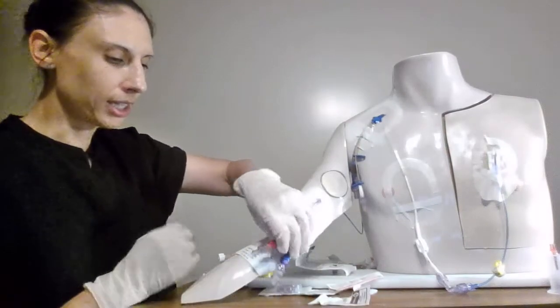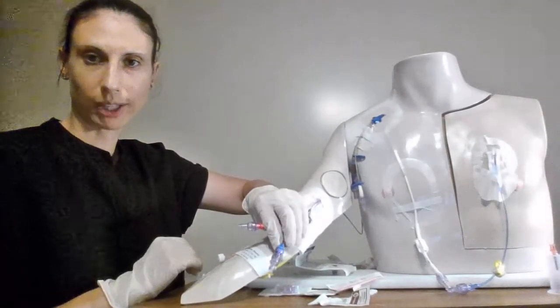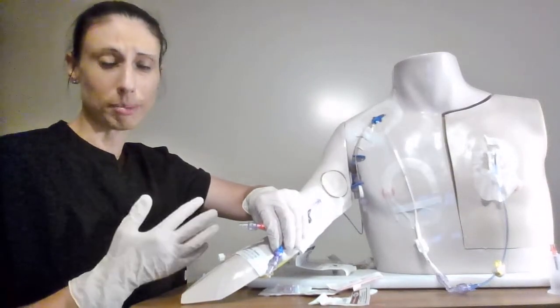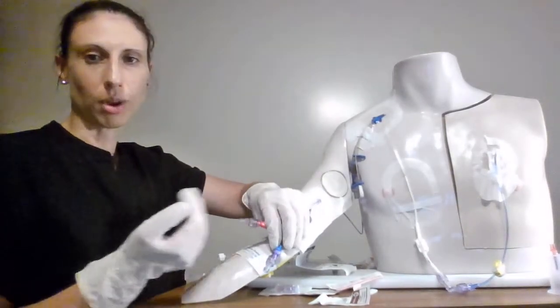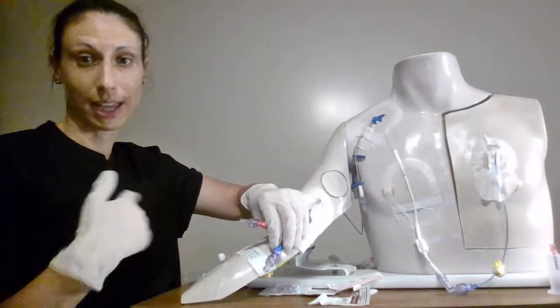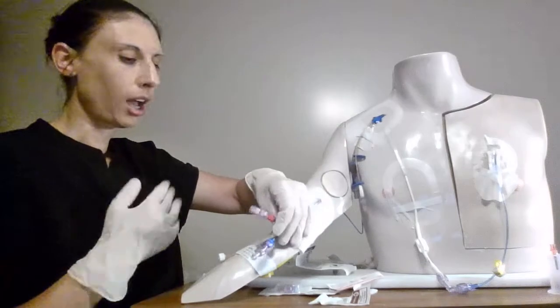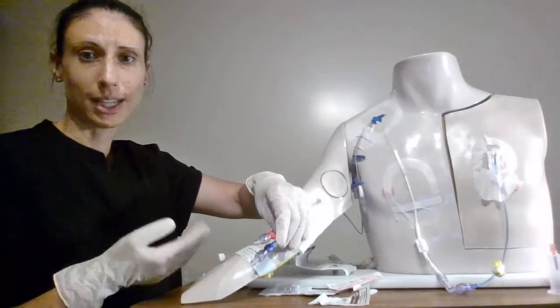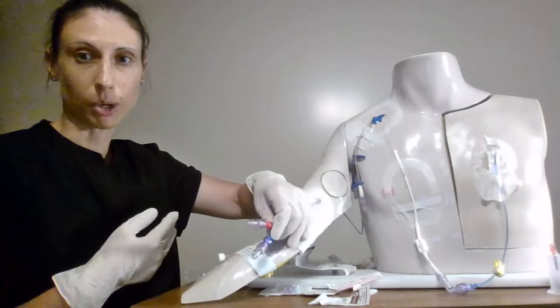So for the PICC if we had an infusion running through one line we would make sure that we stop the infusion and wait approximately one minute just so that we're not drawing back on our line and accidentally contaminating our blood work with that infusion that's running through. I don't have any infusions running through right now so I can pick whichever lumen and it doesn't really matter which lumen you take blood work from.